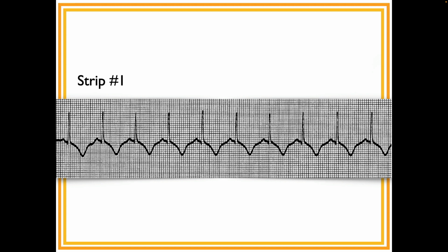So, we'll jump into it right now. How regular is regular? Can we have any variation? Well, we're not talking about a metronome. We're talking about the human heart, and obviously, even if you're sitting there at rest, there are still things happening within your body that are going to speed things up a little bit, slow things down a little bit, you know, respiration, change in parasympathetic, sympathetic tone.